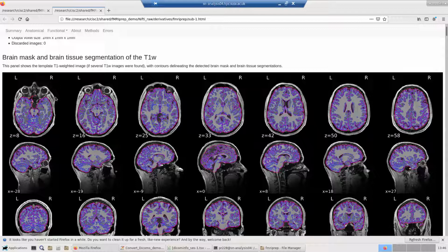One thing to notice about my weird brain is that fMRIPrep doesn't necessarily have a completely automatic way of deciding whether to remove a subject or not. The people that created it suggest you do some semi-visual inspection of the data, partly because they think a lot of the automatic ways may not necessarily be super reproducible and reliable.